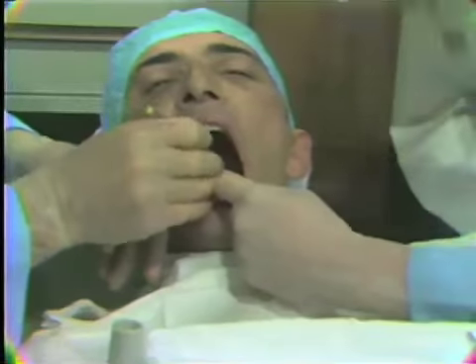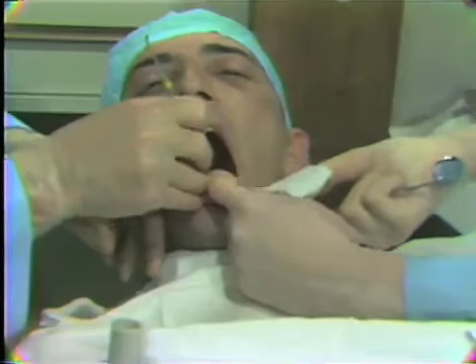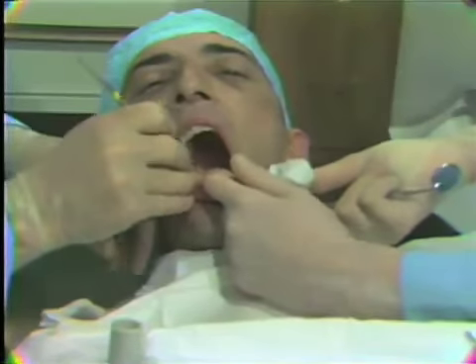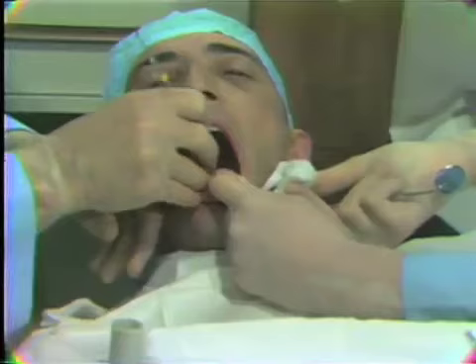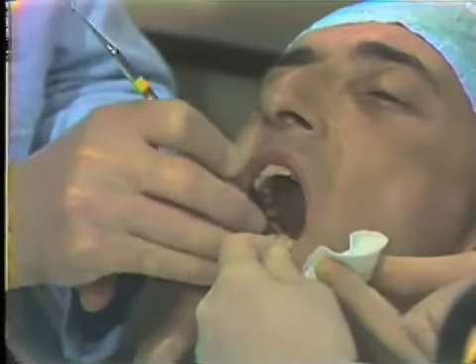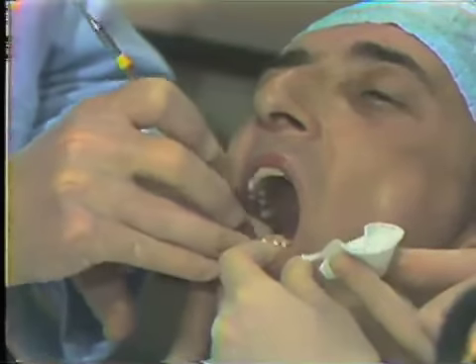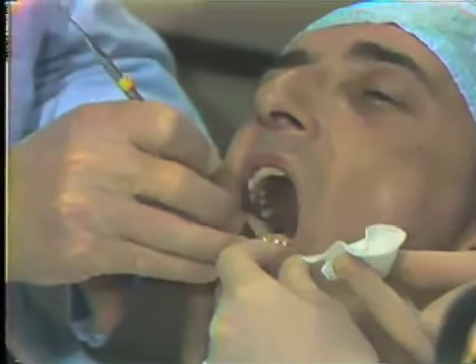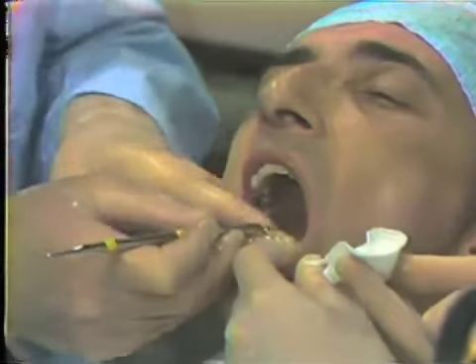We need to guard against having an overabundance of dressing, because the potential for the dressing to flow up onto the occlusal surfaces or onto the incisal edges, and therefore the risk of fracture of the dressing is great. So we, in manipulating and placing the dressing, place it so that it stays into the interproximal areas.